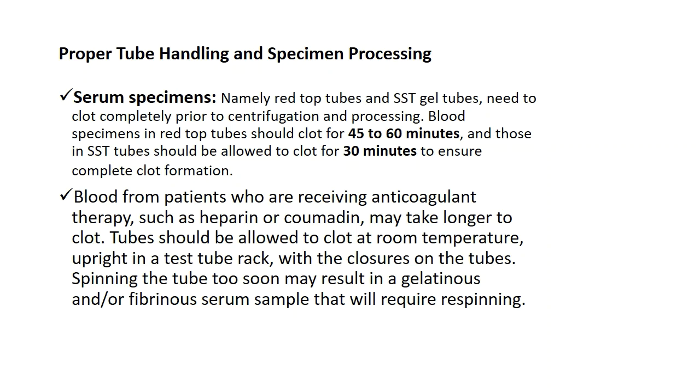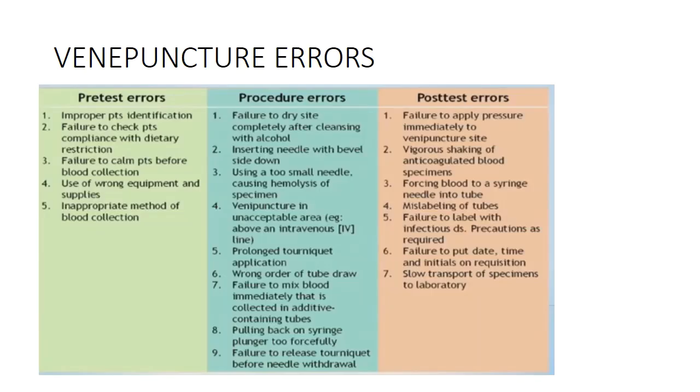These are some of the venous puncture errors, pre-test errors, procedural errors, which may lead to erroneous reports. Sometimes excessive clenching of the fist during collection gives rise to falsely elevated values of some of the parameters.